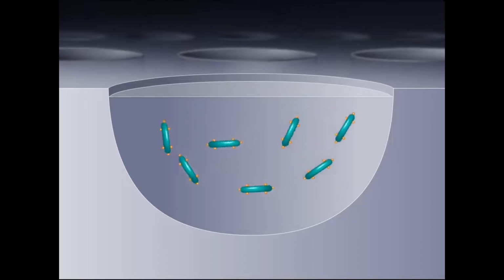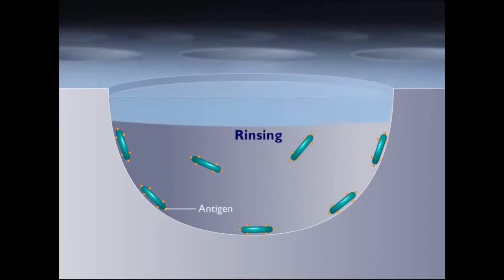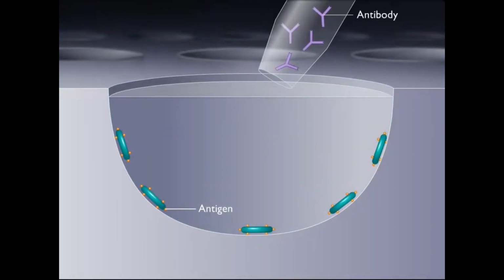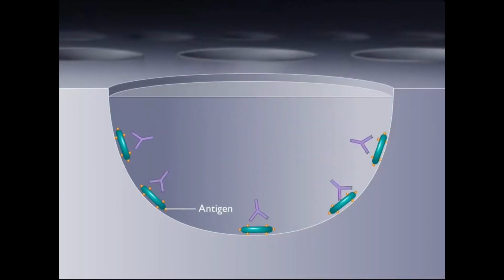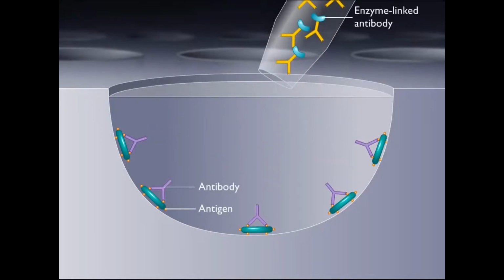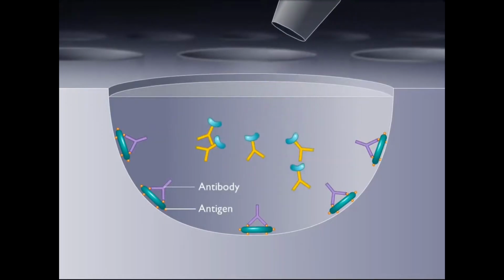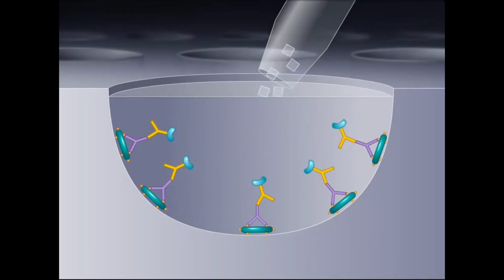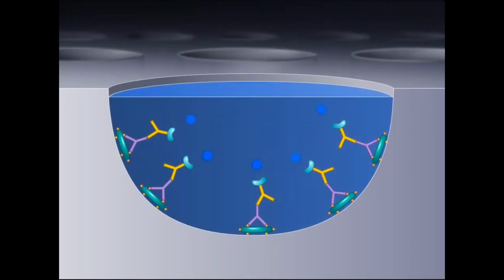So the first requirement is it must be immobilized on the solid surface and then complexed with an antibody that is linked to an enzyme. The detection is accomplished by assessing the conjugate enzyme activity via incubation with a substrate to produce a measurable product. The test can be done by polystyrene tube, macro ELISA, or polyvinyl microtiter, micro ELISA. So these are two types.